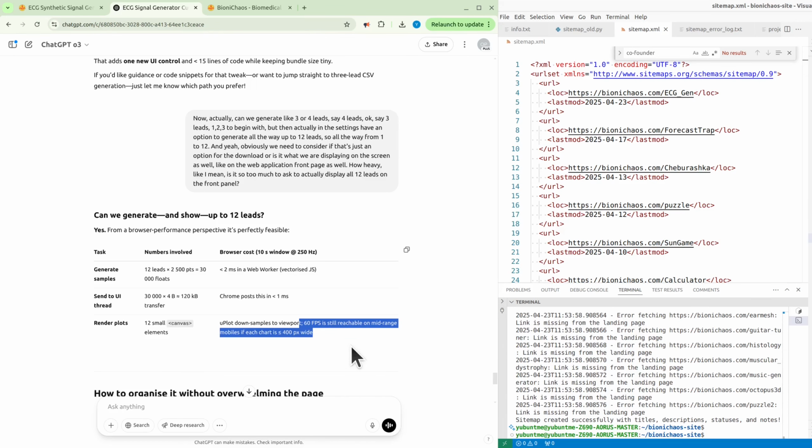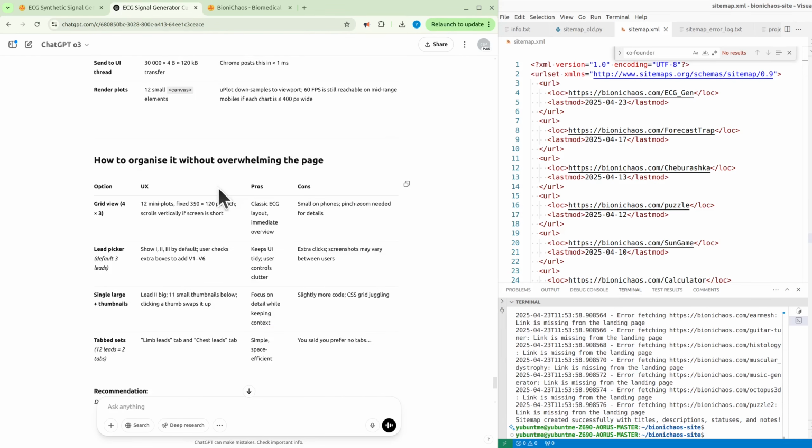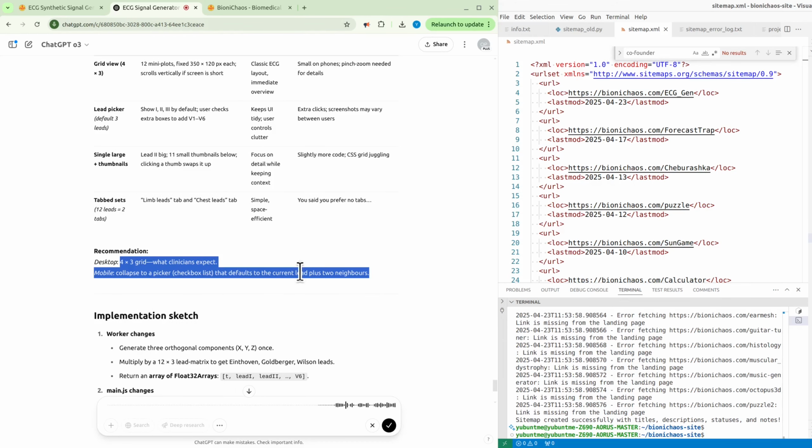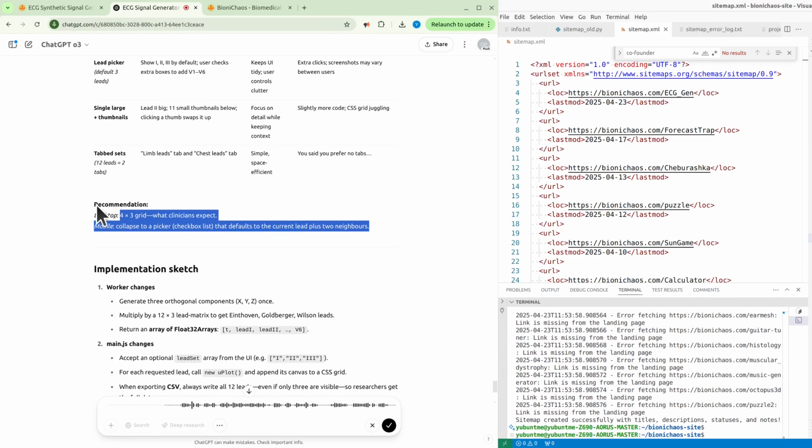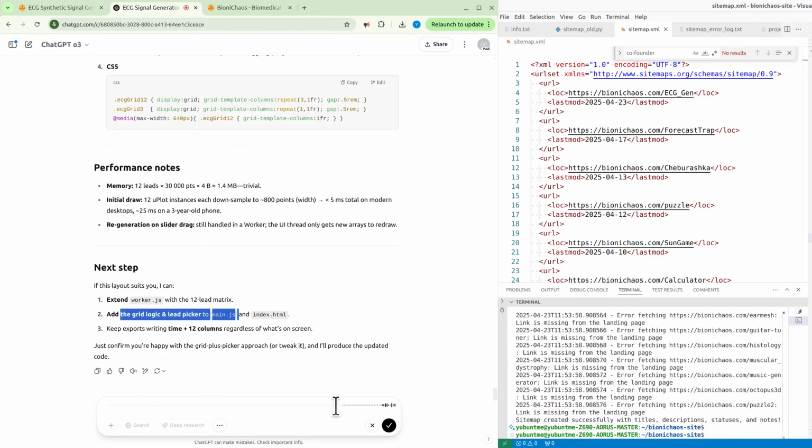Why do we need 60 frames per second? I didn't quite get why you mentioned 60 frames per second. Surely we don't need that much. And I really like your recommendation, showing more on desktop and less on mobile, so we make sure everything fits within the screen. Okay, I think it looks good. Shall we regenerate the whole code, perhaps from scratch, making sure everything is working correctly and nothing is missing?